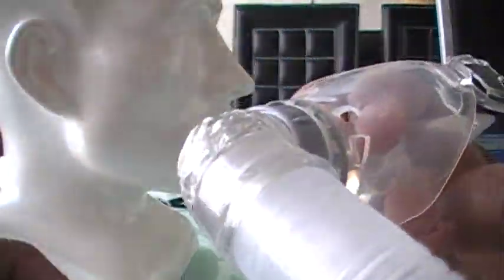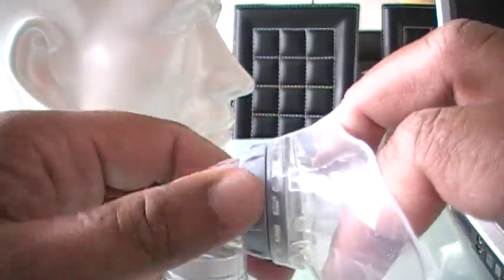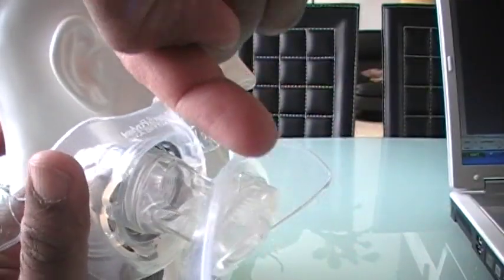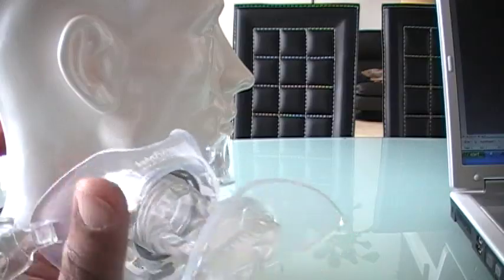Pretend my fingers here are your lip that's holding it in place. You see this dial? If you turn this dial, what's going to happen is this piece here will either extend out or retract back. You can put it to your comfort.